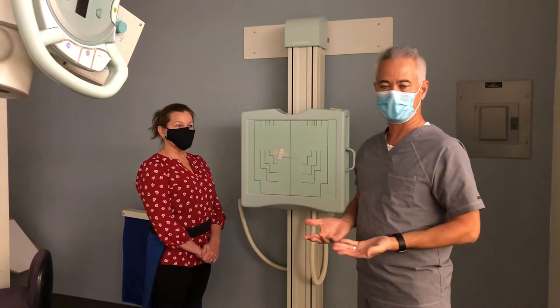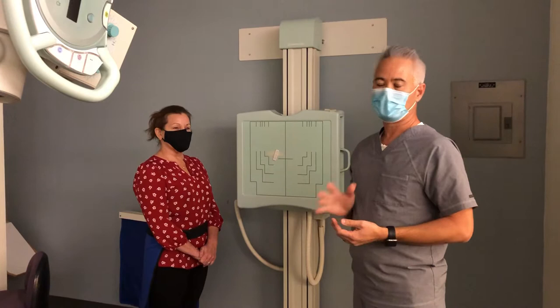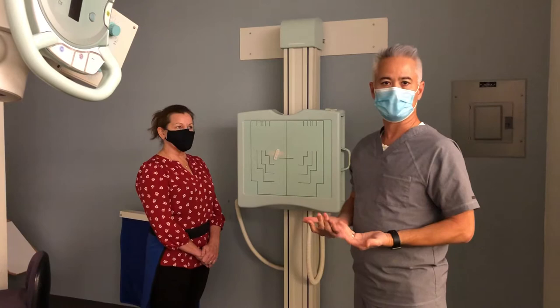Some older techs learned how to do them AP, so they just do them AP because they're a little afraid to try PA. You can certainly learn from them how to do APs because you have to know how to do that in a trauma situation. But if you're doing routine cervical spine x-rays, you should do them PA just for the dosage reduction to your patients.